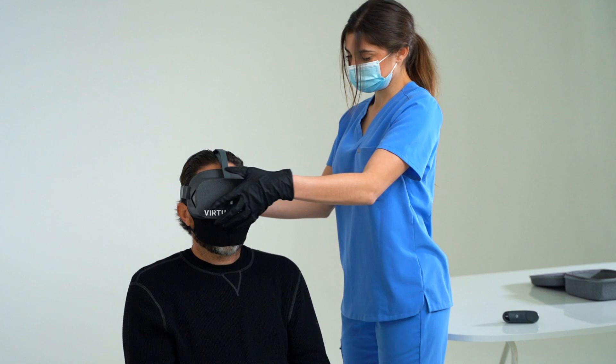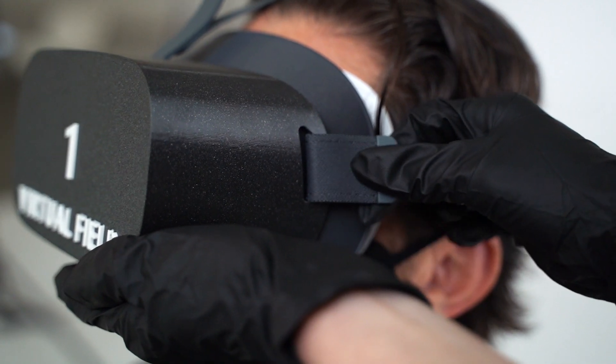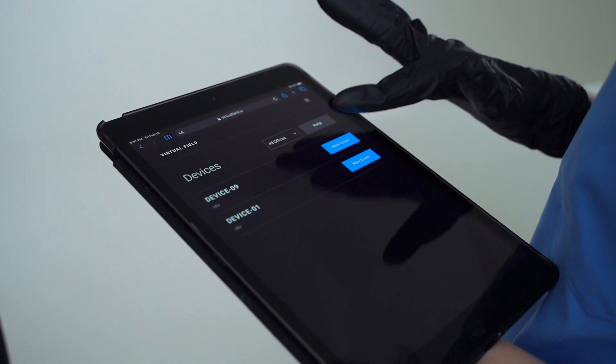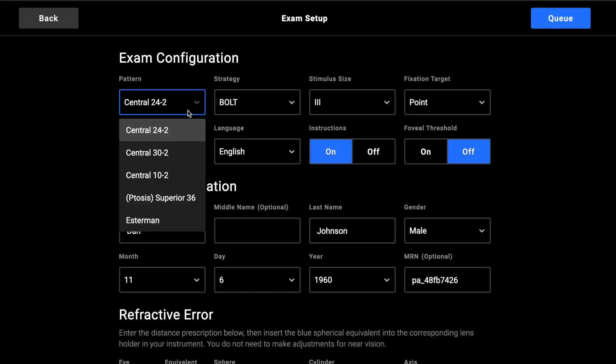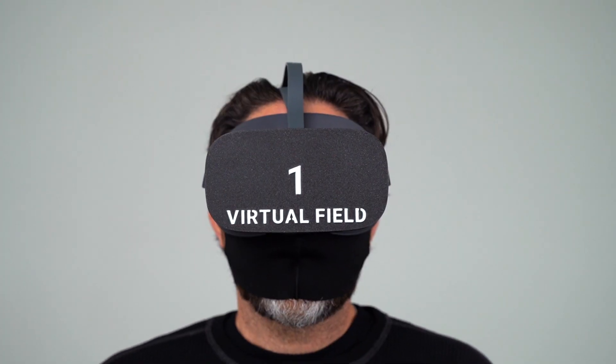Tests are managed by logging into the Virtual Field dashboard on any desktop, tablet, or mobile phone. The instrument itself only requires a Wi-Fi connection. Starting a test is easy: log in, select the device, enter the patient's information, then pick from our suite of tests — 24-2, 30-2, 10-2, and more — and cue the exam to begin.